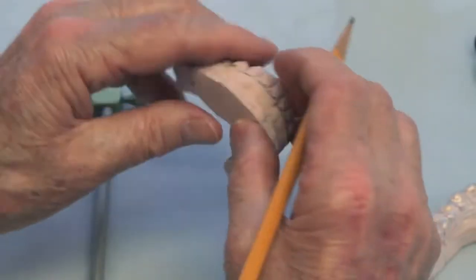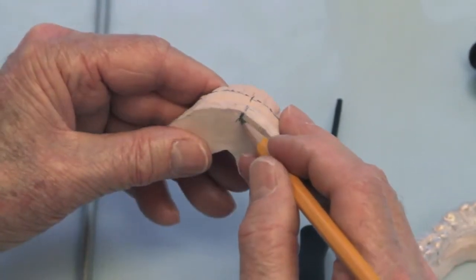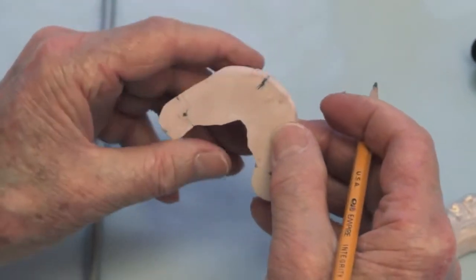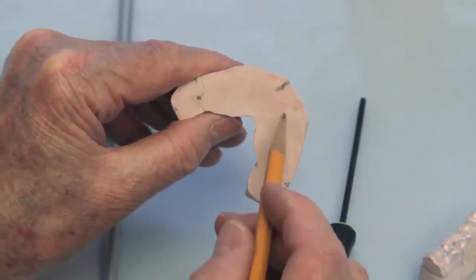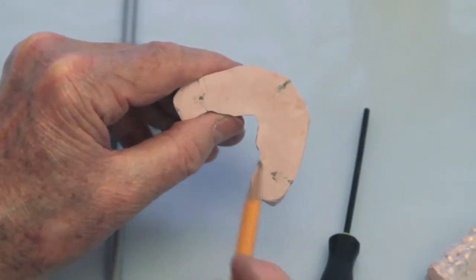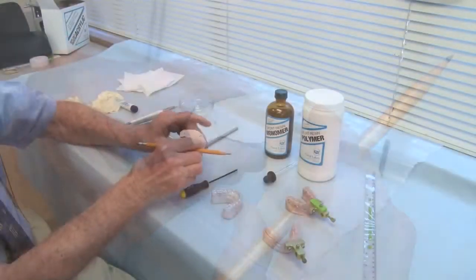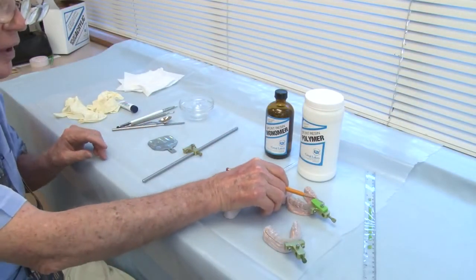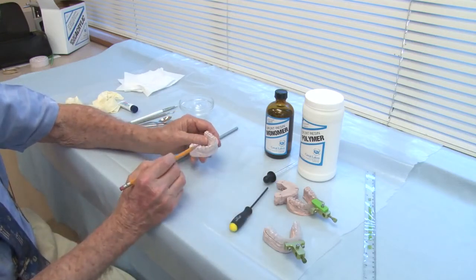Mark the midline, come down and mark it on the lower model so that you now have the midlines lined up, the midline on the lower model and the central fossa of the lower first molars on the bottom of the lower models. The next thing that you do is you adapt a Biocryl base.